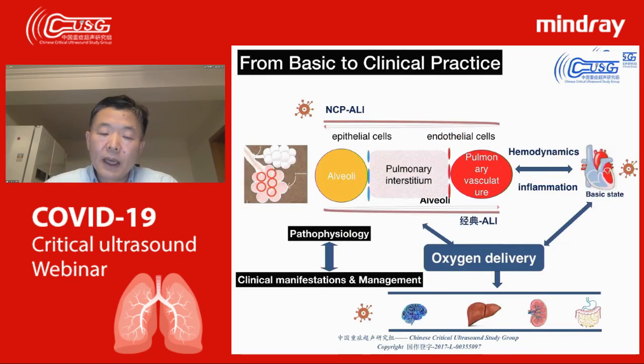Now we have to go into our practice part. If you use this kind of pathology information, image information, now you have to think about the pathophysiology part.